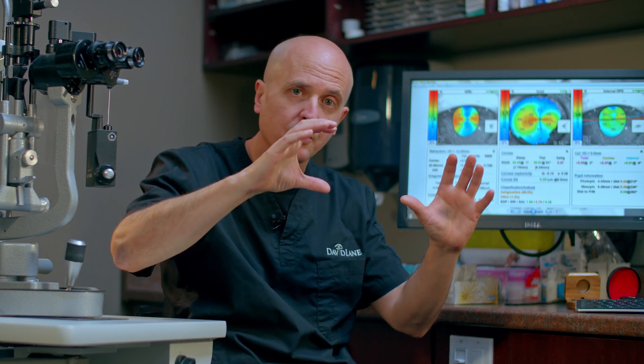A toric implant is a special implant that has an axis to it, so the implant can actually be rotated inside the eye. That axis needs to match the axis of where the astigmatism is, and that's how the implant works and gives sharp distance vision.